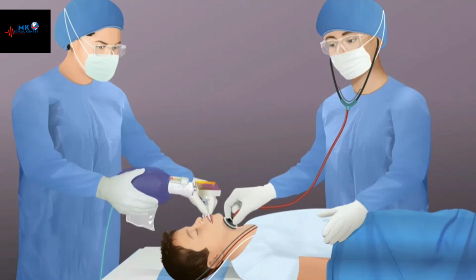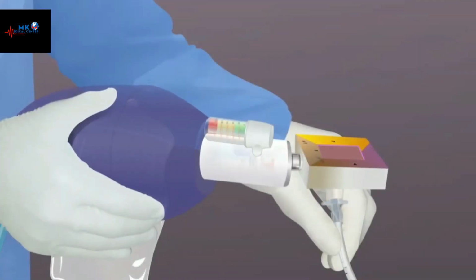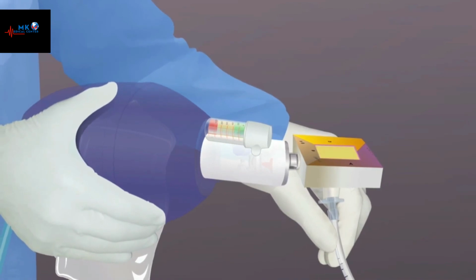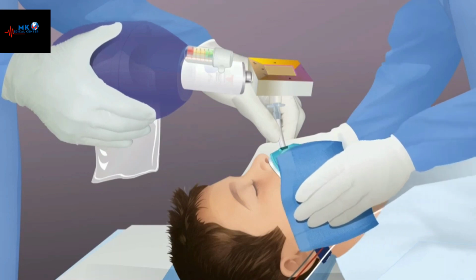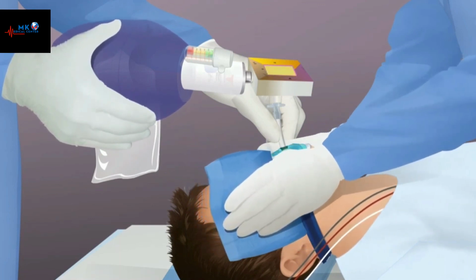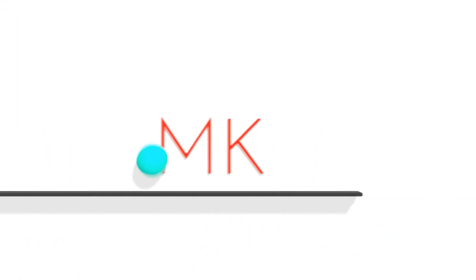Place a stethoscope on the anterior neck overlying the trachea with the child's head in a neutral position. With a manometer connected to a ventilation bag, administer positive pressure ventilation while auscultating for an air leak. Clean the child's face and secure the ET tube while the child's head is in a neutral position. Obtain a chest radiograph.